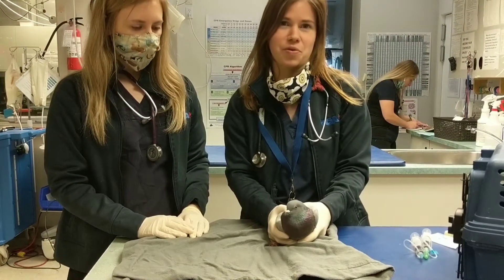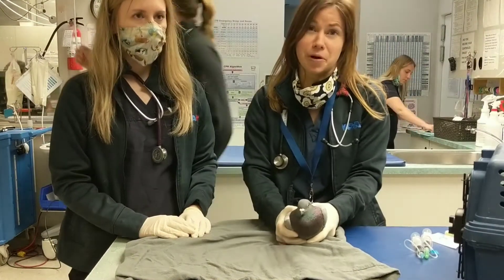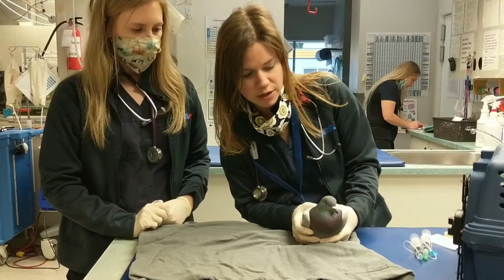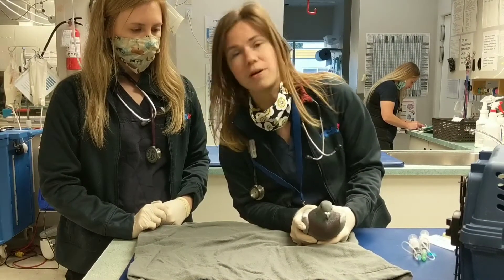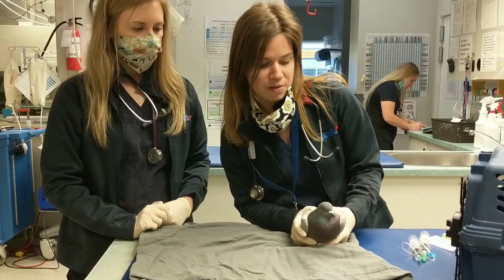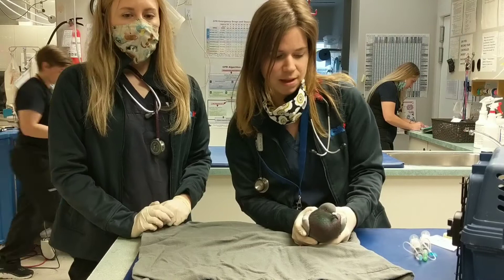Hi, my name's Lauren. We're going to go through how to give subcutaneous fluids to a bird. So we have a pigeon here. Pigeons are a really good learning bird — they're really easy going, pretty chill. So we're going to go ahead and use him.